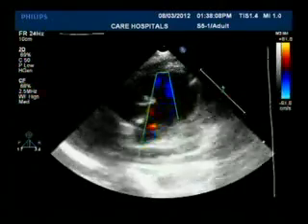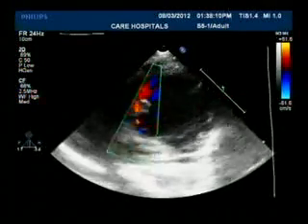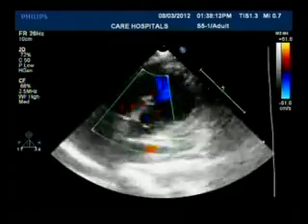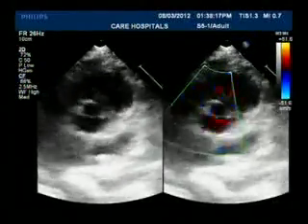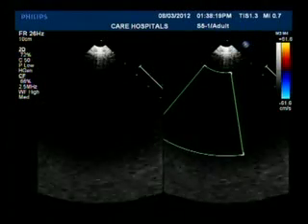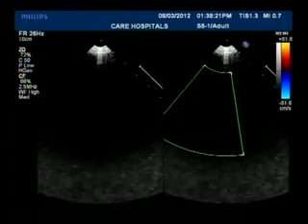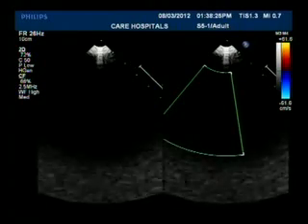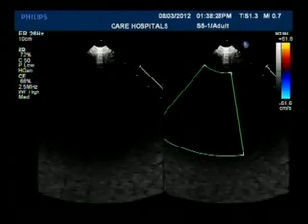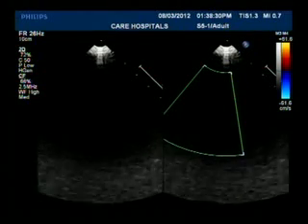So he has released the distal disc and he's pulling it back into the aneurysm. Can you take out your hand? At this point it's important that I slowly release the central waist, and I won't pull the sheath at this particular point.